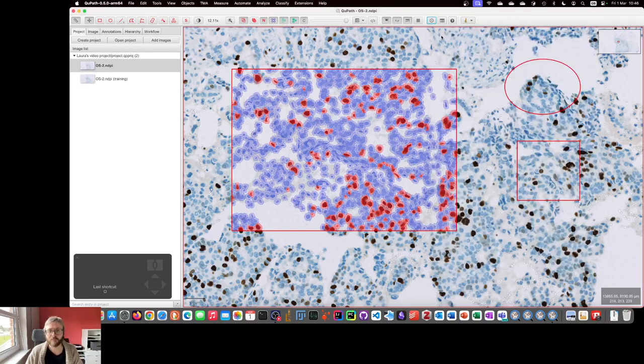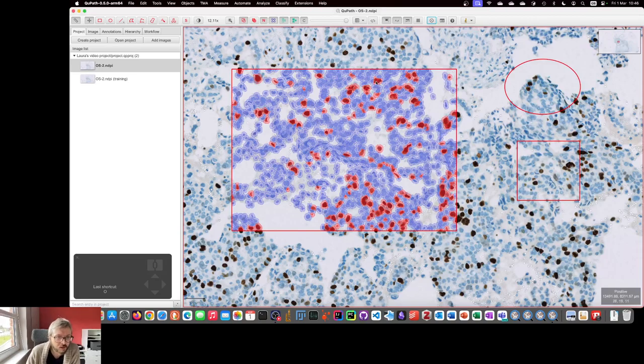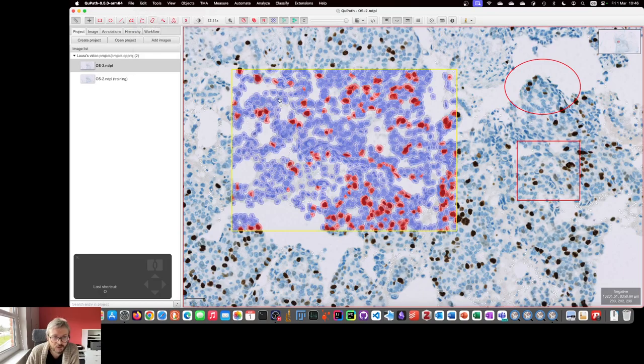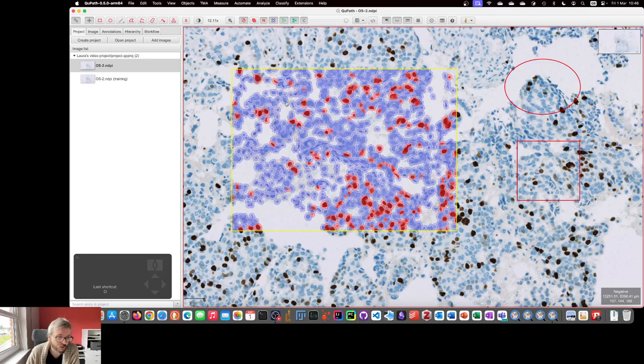You can adapt the parameter if you need to, but this basically is a way of controlling that you've got Undo whenever you're doing lots of manual annotations, but you don't necessarily have Undo if you're working with huge regions. So, wouldn't 100% count on QPath's Undo. It's also a slightly strange behavior. Sometimes you need to select it twice when you expect to only select it once. So, it's not great, but it is the easiest solution to the problem in the case where it works.